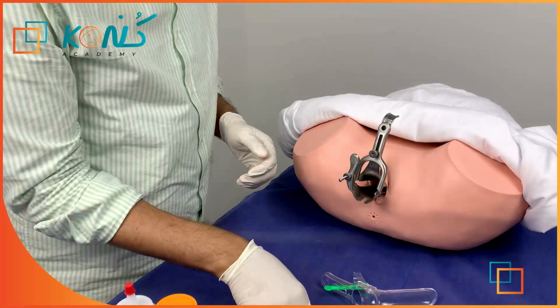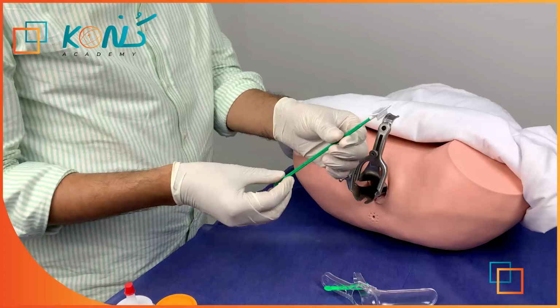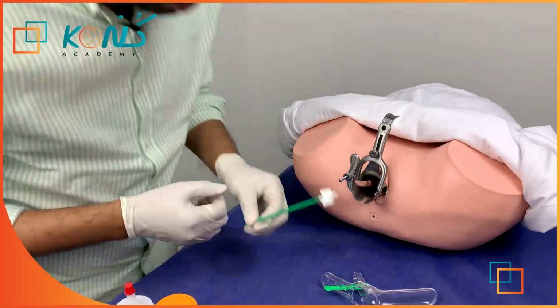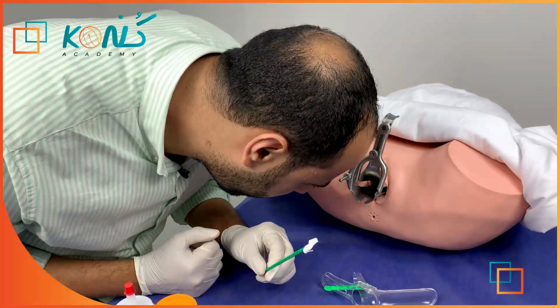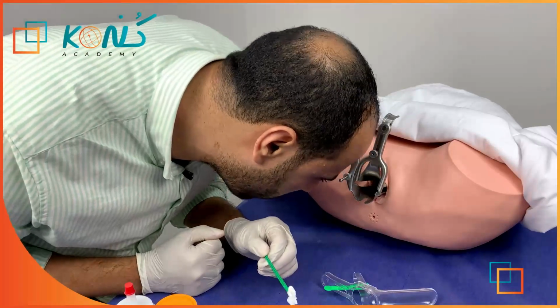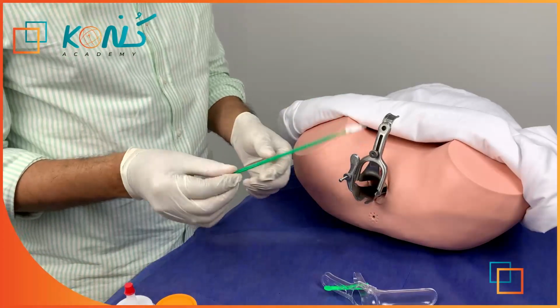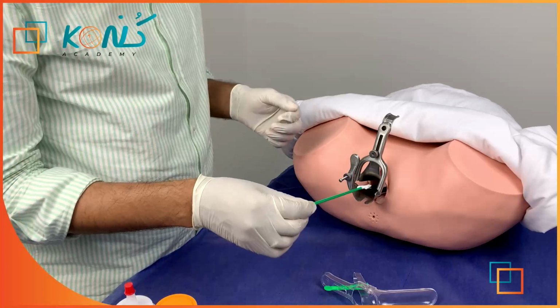If I'm about to also do cervical screening and take a swab using this endocervical brush, I can tell my patient, after just having a look to see if there is any prolapse, any bleeding, any discharge: Mrs., right now I'm about to put this brush to take a sample from the cell lining of the cervix. Is it okay? Yeah.